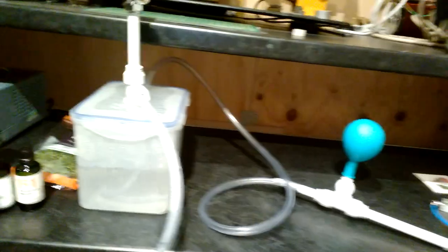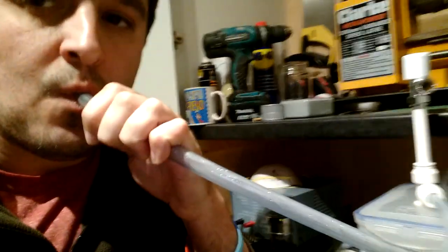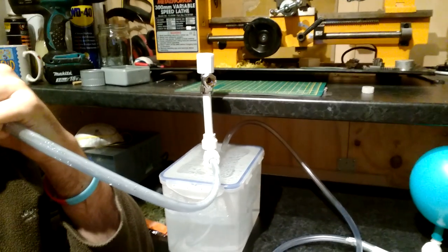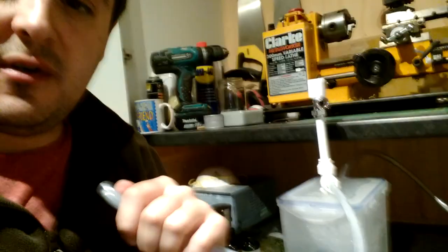So, I'll now show you how this works. If I open this valve here, the balloon starts to inflate. You can see the bubbles coming up through there. If I put my thumb over the pipe, you see the balloon inflating. That's pressurizing the air in the system. I can now breathe. Breathe the air. Taking in a good amount of air, which, because it's at pressure, fills my lungs to maximum capacity.